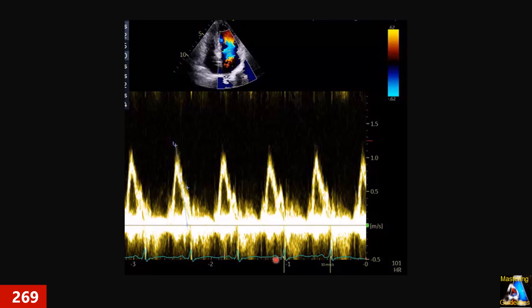Here we have Doppler on the mitral valve. You can see the EKG, and the tech acquired this for the mitral valve inflow E and A waves. Where is the correct measurement for E and A in this case? Do we measure both of them or not? Where is the slow deceleration time for the E wave? And for making this more accurate and correct, what should we do to get this study done better?